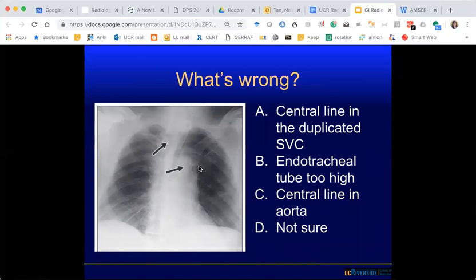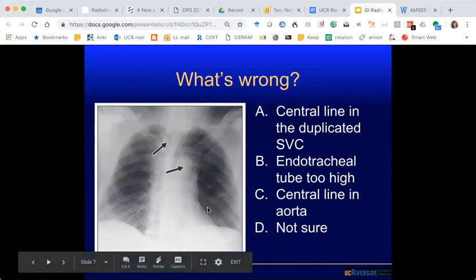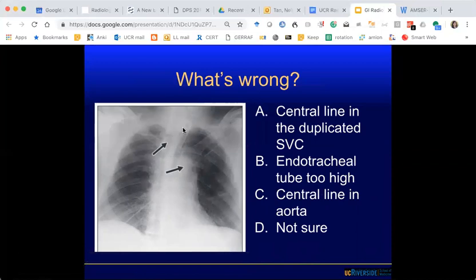What is the diagnosis in image B? It's probably a portable — the heart is kind of big and the image quality is not great. We always start with lines and tubes, so it's a trach. There's also a catheter here that looks like a PICC line because you can see it crossing along the subclavian. What is wrong with this image? The central line is crossing to the other side of the midline — maybe it's a central line in the aorta.